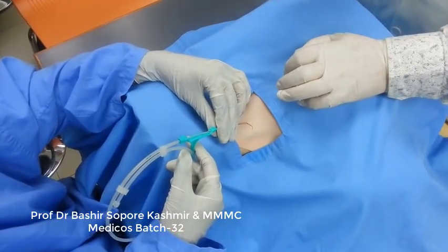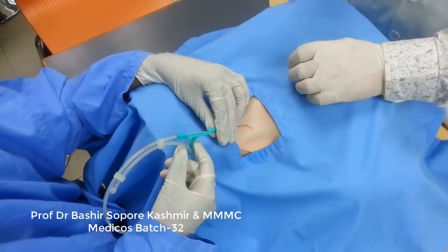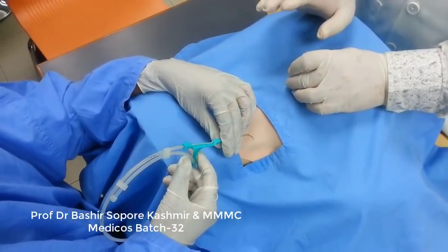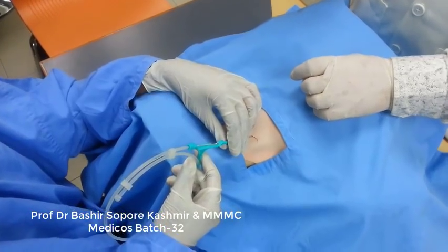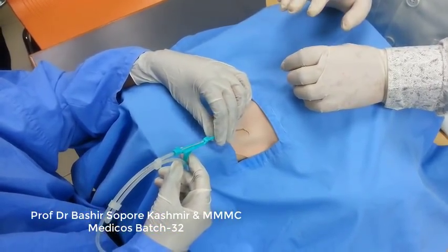So that means we should introduce the catheter between 12 to 14 centimeters. It is safe. 12 centimeters is very safe. If you try to go 14, 15, 16 centimeters, it is going to go deeper and deeper. We don't need to go so deep.